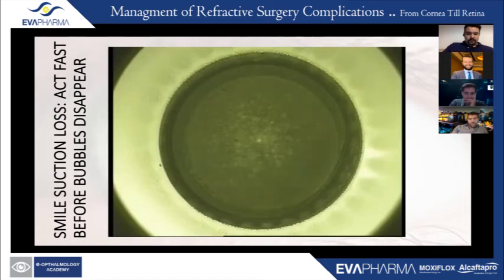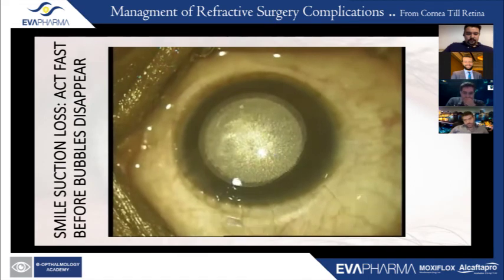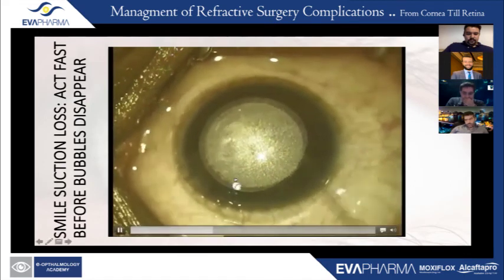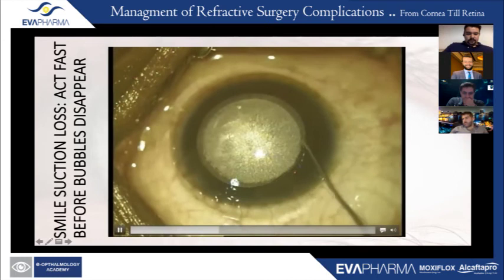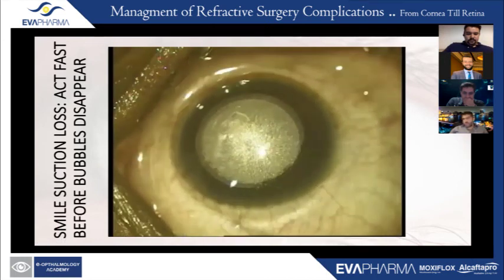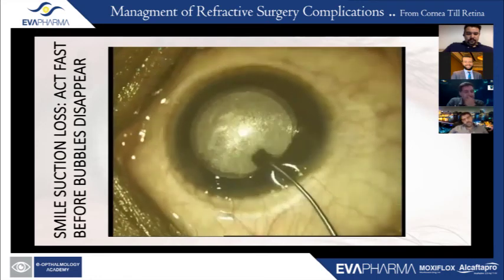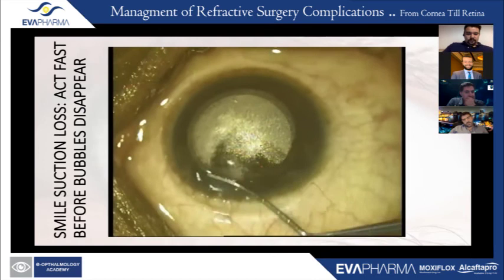So it's low vacuum, and any excess fluid or slight movement by the patient, or attempts at getting confused and attempting to fixate on the green light, especially when the first laser passes over and the green light starts to become less visible to the patient, apprehension on the part of the patient can lead on to suction loss. So that entry cut is not there.